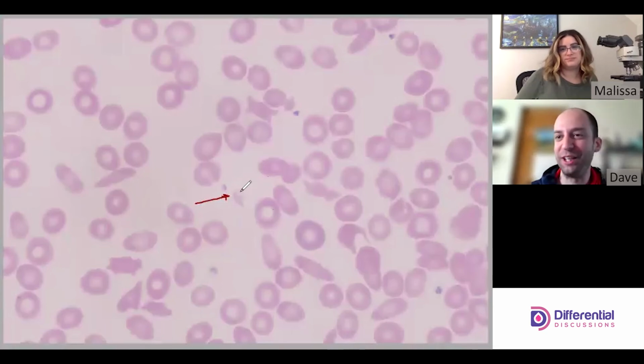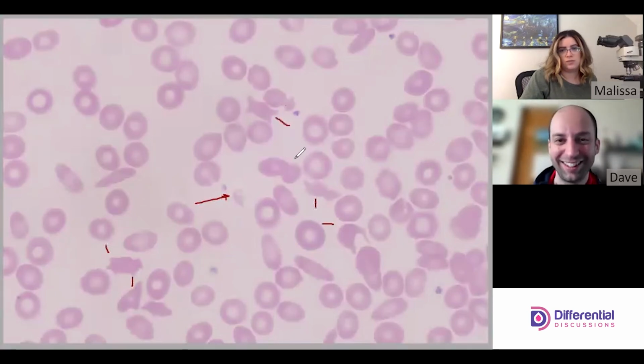So the size really factors in big here, right? Yep, absolutely. And then compared to him, you have acantho... Oh, and there goes my little drawing guy. Let me bring him back. Okay. Acantho, probably an acantho, definitely an acantho. This is one of those pinchy cells here again.